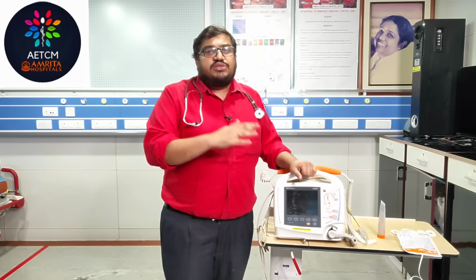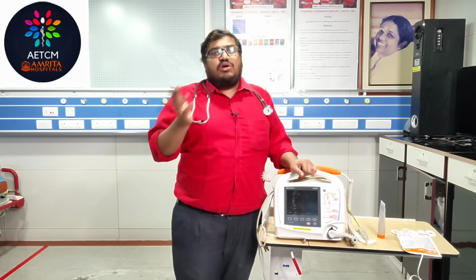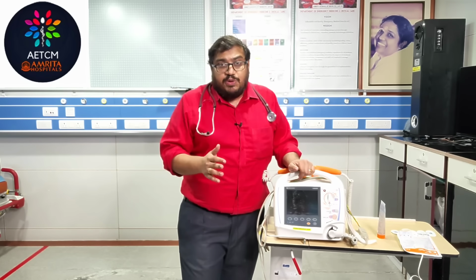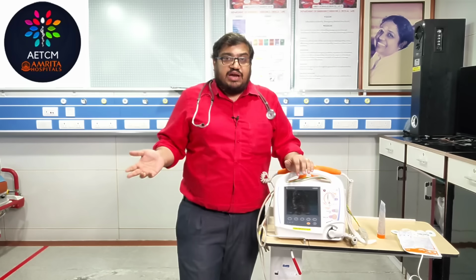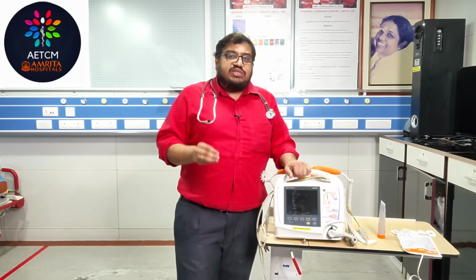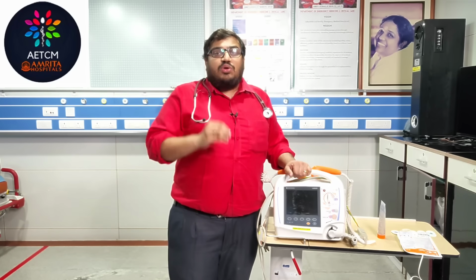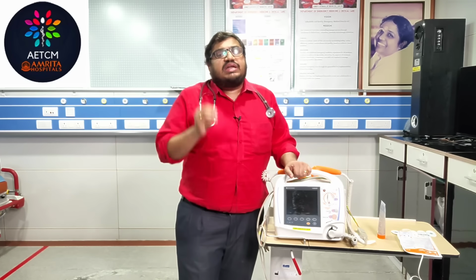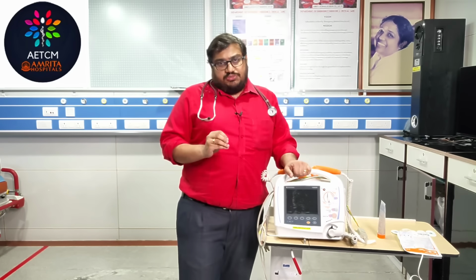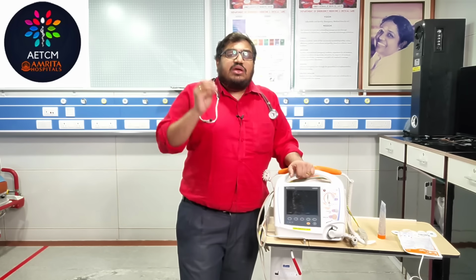You know there are different types of arrhythmia. You can have supraventricular tachycardia, atrial fibrillation, multifocal atrial tachycardia, and ventricular tachycardia where the patient can have a pulse. So these are different types of tachycardia. For that purpose, AHA in ACLS has decided that a narrow complex regular tachycardia, which can be an SVT, you need to start with 50 joules.